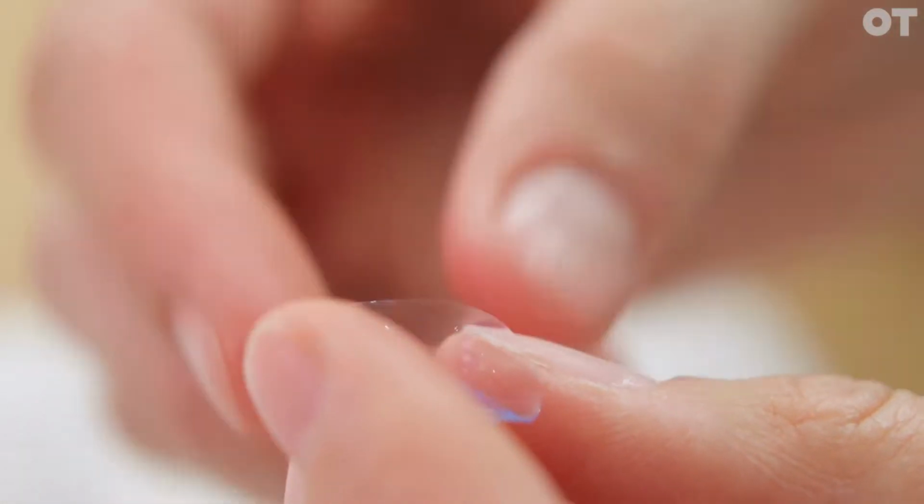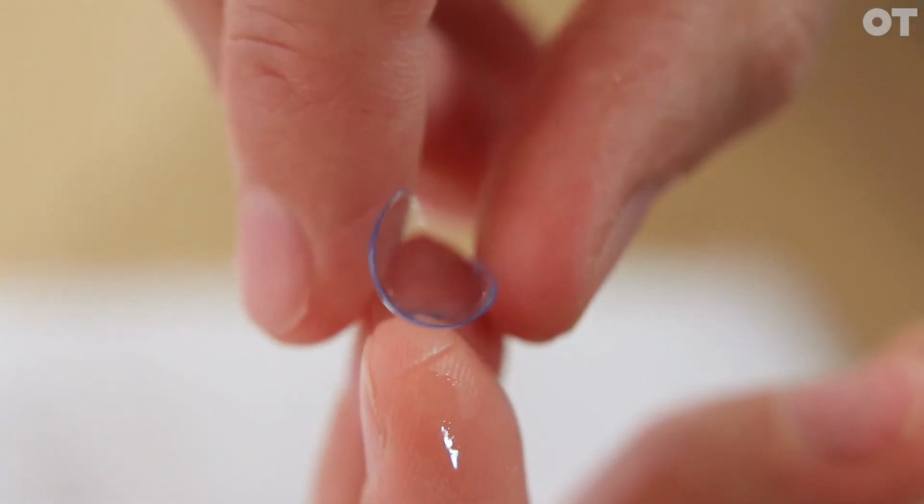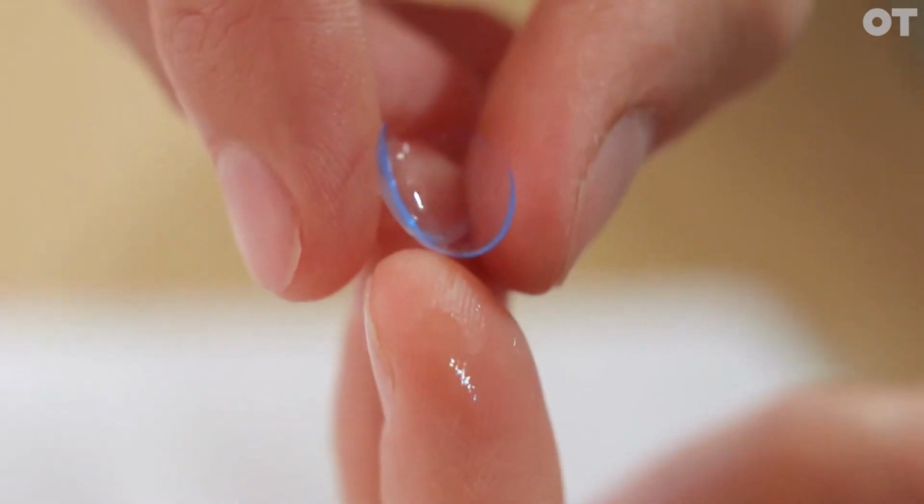If you put it on the crux of 2 fingers, it helps you hold that lens a little bit better. Or sometimes the tripod technique where you put 3 fingers together and then you balance the lens in that little tripod. So rather than trying to bring the lens up to the eye, if you bring the head to the lens instead, so maybe put the mirror down flat on the surface they're working over, and they look over that instead of bringing everything up to vertical, that can help.